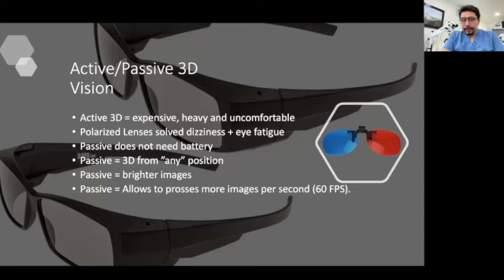My first doubt when I was making the decision of going for the 3D or not was because when I go to the cinema to see a 3D movie, after 1 hour, I start having headache, dizziness, and eye fatigue. And I asked the people from Zeiss, guys, if I go to the movies and see a 3D movie, after 1 hour I'm feeling bad. Eye fatigue, headache, dizziness, and what can I expect if I work with the microscope all day long?